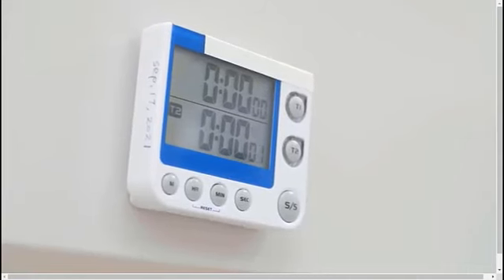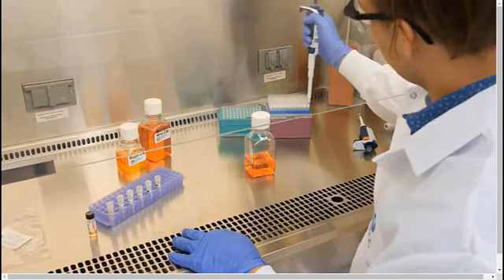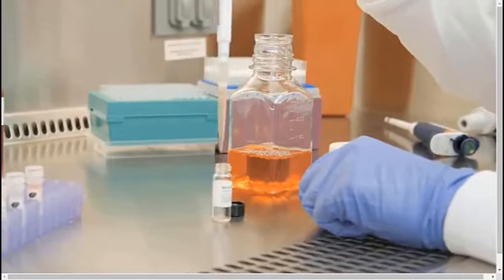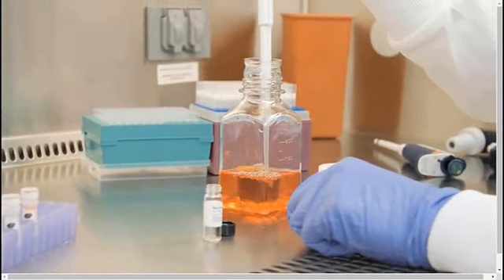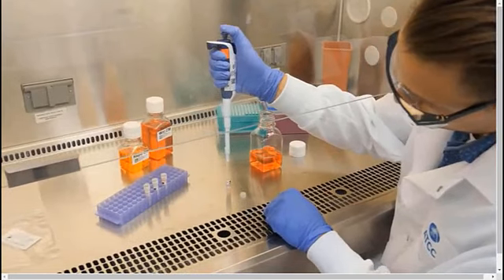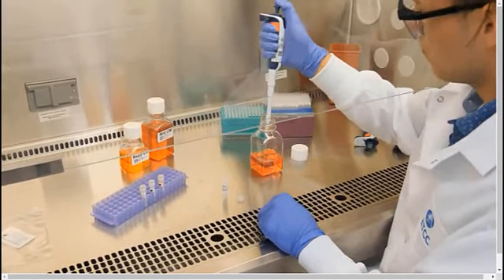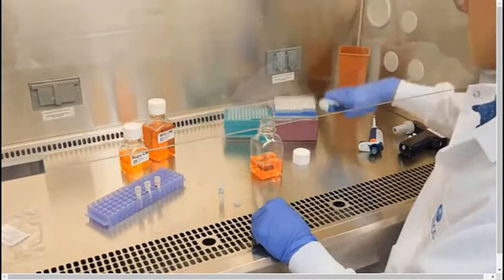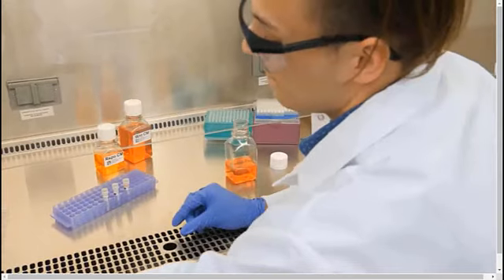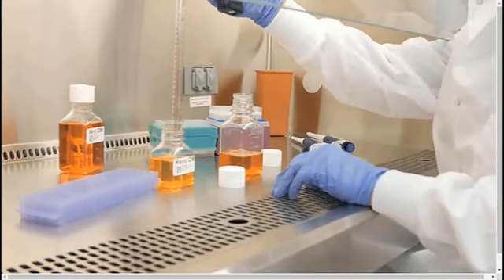After the reconstituted kit components have been incubated for 15 minutes, add them to the previously supplemented basal media. Add any additional reagents indicated in the media formulation, such as conditioned media.